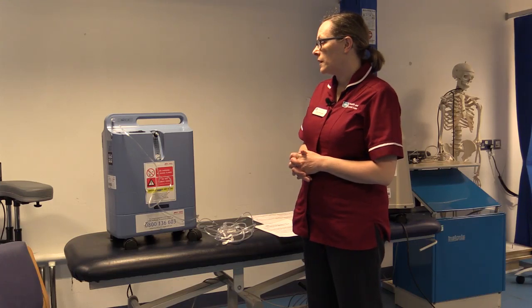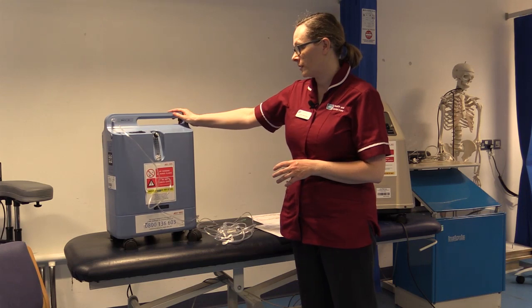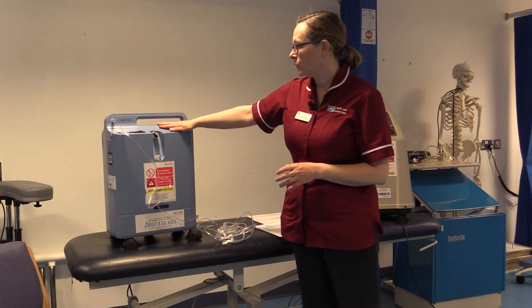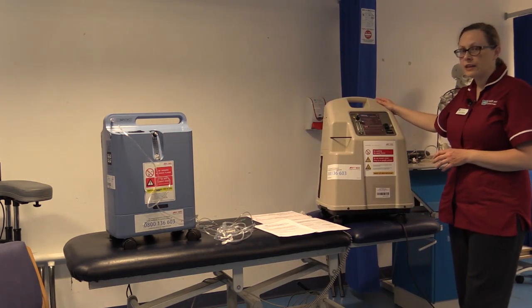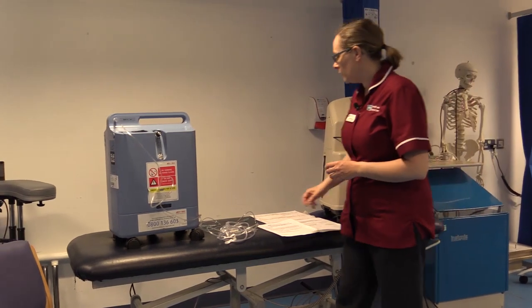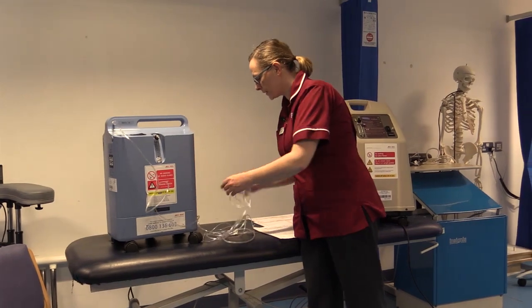Within the home, the main device for delivering oxygen will be an oxygen concentrator. This is an example of a standard flow oxygen concentrator, which will go up to 5 litres, and this is an example of a high flow, which will go up to 9 litres. Within the home, the oxygen will be administered via 2 methods.